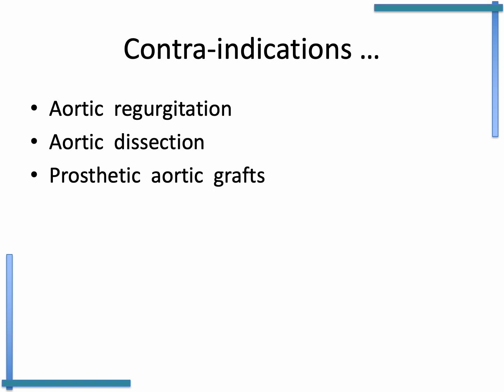And then also if patients have had prosthetic aortic grafts, so repairs of previous thoracic aortic aneurysms with synthetic grafts, we wouldn't consider a balloon pump for insertion. And this last contraindication is perhaps a little bit more relative, but for patients with severe aortoiliac disease, we try not to put the pumps in. And it's unfortunately not that infrequent that we have a patient in the unit who has a cold leg post-insertion of a balloon pump.